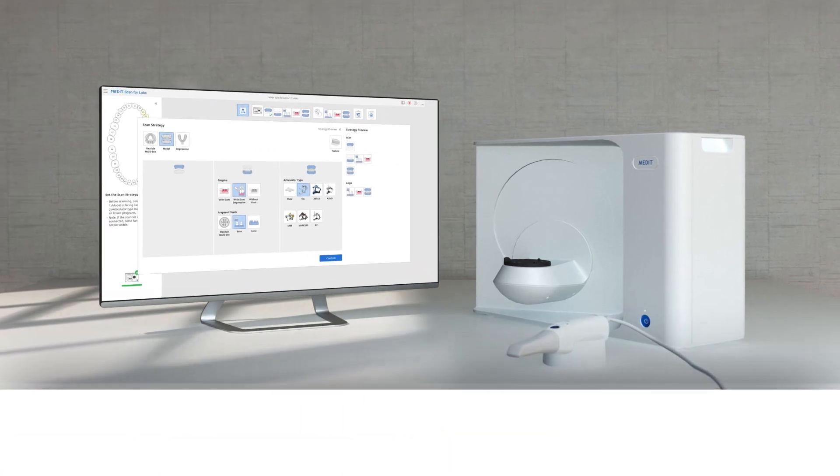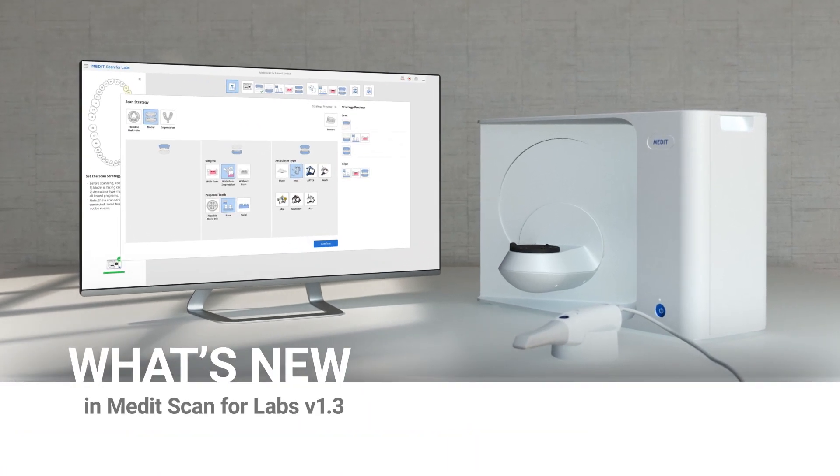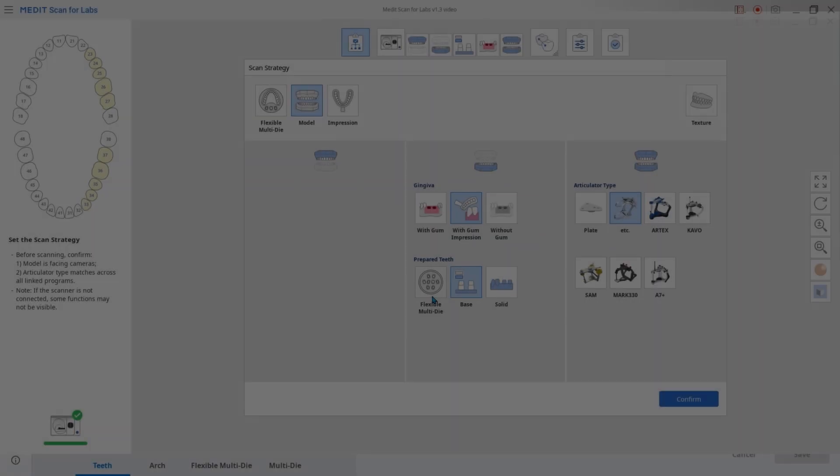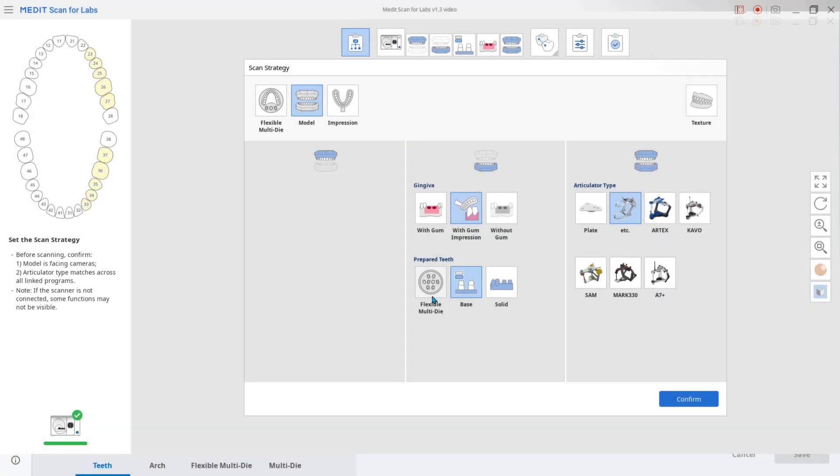We'd like to introduce you to the updated version of MedicScan for Labs. Let's start by looking at the new feature, Strategy Preview.